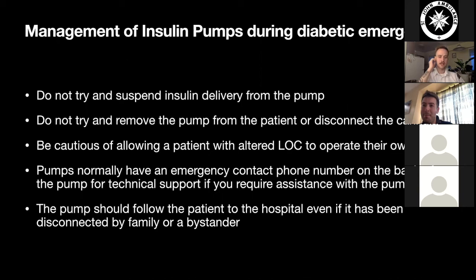Like the last example I gave, right? My dinner last night, the dinner I just ate, I took 6 units of fast-acting insulin, and my basal insulin, I get just over about 0.6 of a unit an hour of basal insulin. The proportion of insulin that someone is going to have had to take of too much bolus insulin to put them in a hypoglycemic state, you can very quickly overcome that either with oral glucose, intravenous glucose, or if you have to, glucagon. It's not a huge amount of insulin, and the chances of messing something up, doing something incorrectly when you start messing with an insulin pump are just much higher, versus it's quite easy to overcome the background insulin that's being given there.